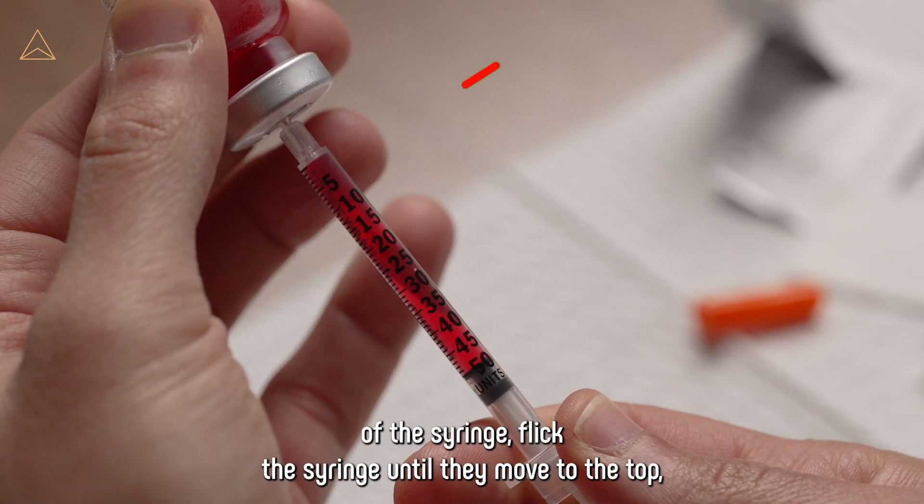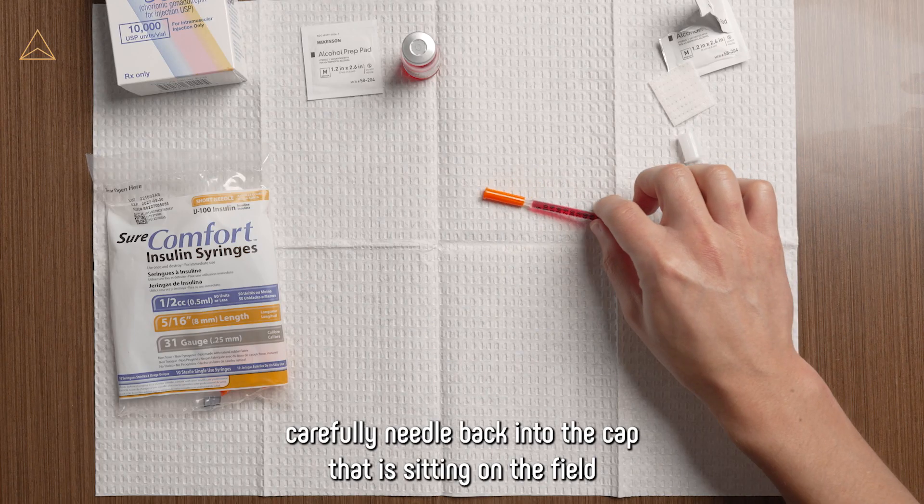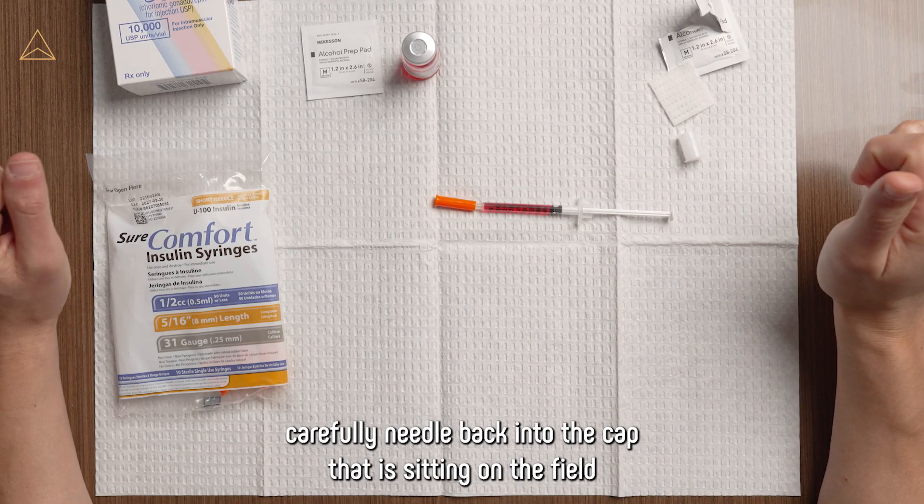If the bubbles are not at the top of the syringe, flick the syringe until they move to the top. Carefully replace the needle back into the cap that is sitting on the field.